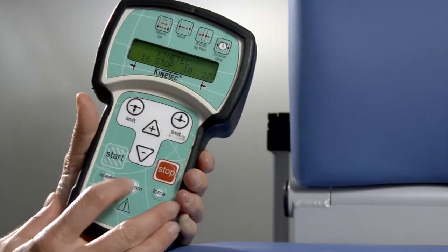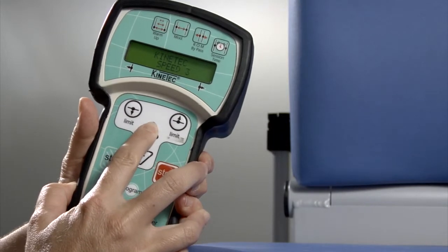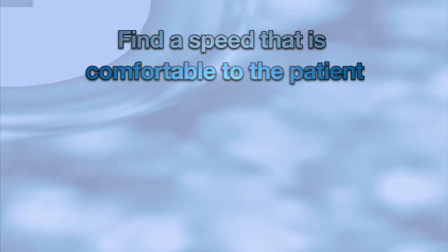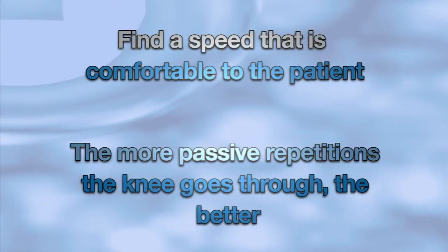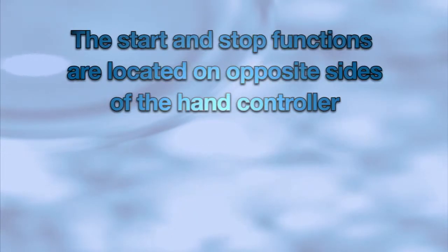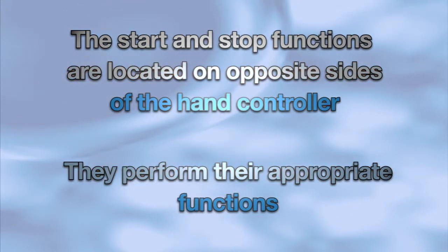To adjust the speed of the machine, simply press and hold the speed button and adjust by pressing the appropriate arrow. Find a speed that is comfortable for the patient, keeping in mind that the more passive repetitions the knee goes through, the better. The stop and start functions are located on the opposite sides of the hand control, and they perform their appropriate functions.